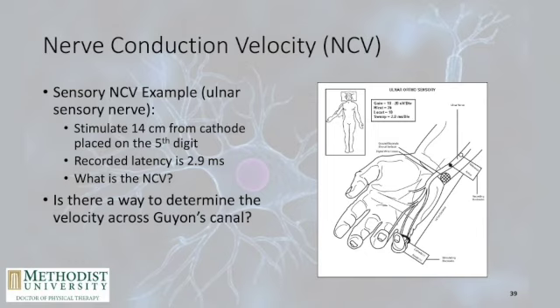So looking at the schematic here of how nerve conduction velocity is going to occur, this is going to give you a little bit of a math problem. So pause the slide here, do the math problem.